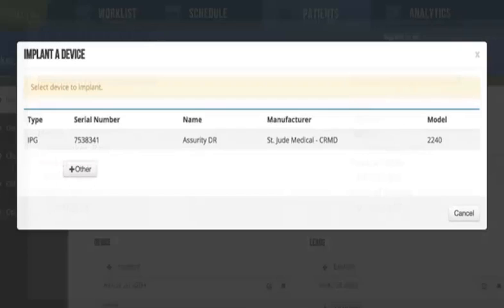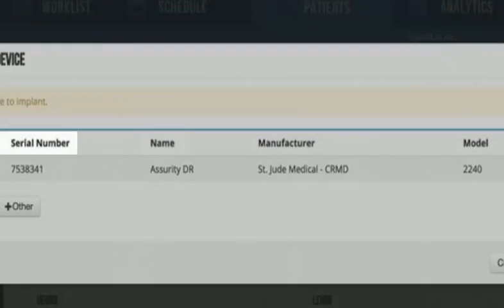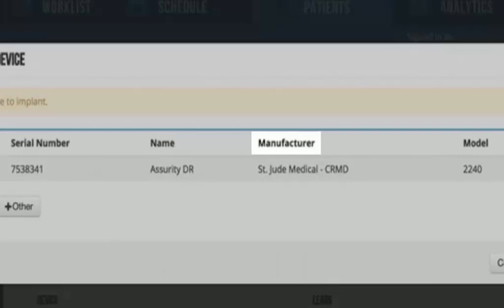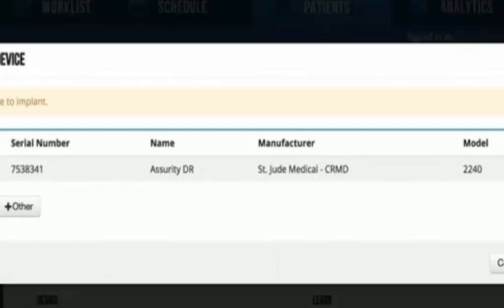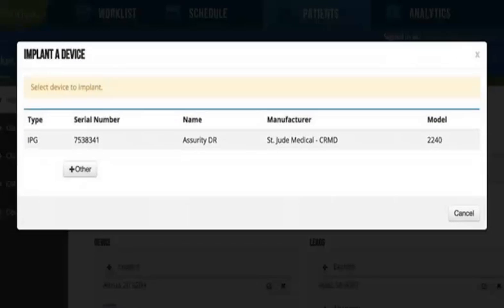Click the plus button in front of device implant and users will get a modal with the serial number, model name, manufacturer, and model number. Click the row to select it for implant.